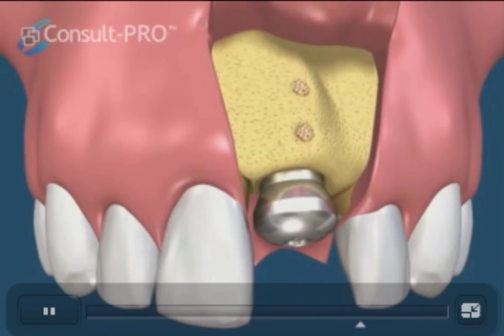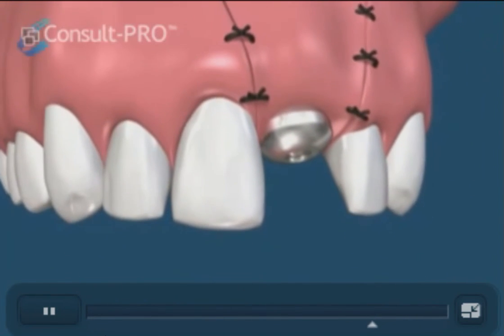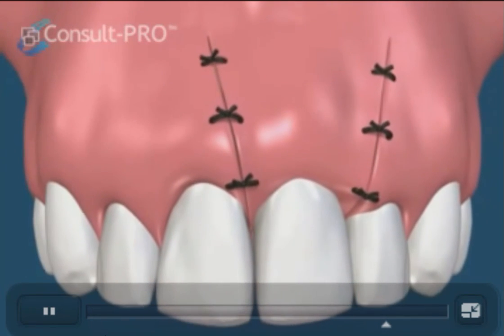The healing cap is placed at the same time as the implant. During the healing phase, the patient can still wear the removable partial denture. The area heals and the sutures can be removed or dissolved.